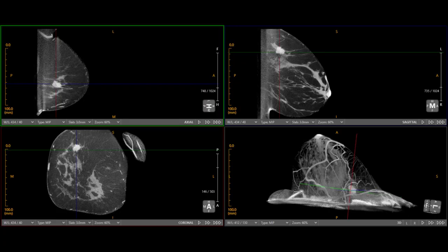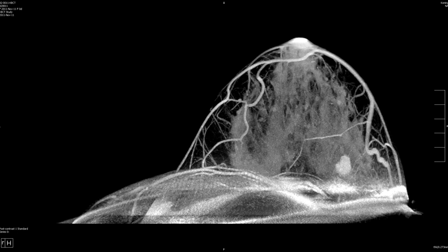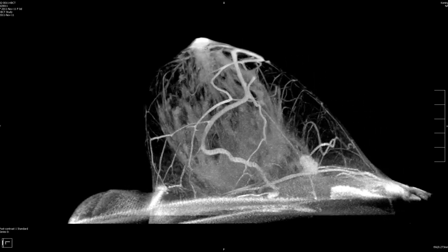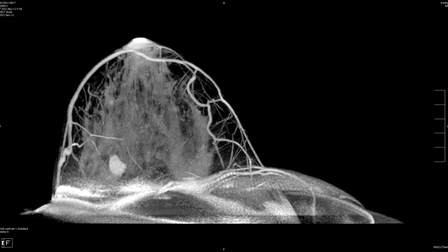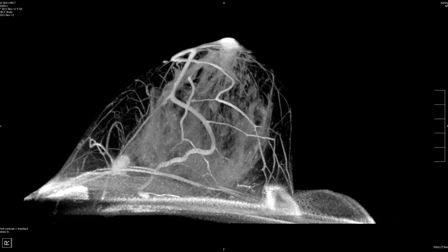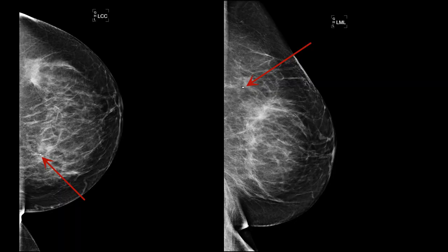Now, with contrast — it's like you switch the light bulb on. You put in contrast and then it jumps. Where else in the body would you ever do a scan for cancer and not give contrast? For dense breasts, we probably need contrast. Here's the contrast exam — it's even more so. That was the lesion in the upper inner breast. She was biopsied and it was cancer. But looking now, all we've done is a needle biopsy, and the cancer without contrast is not as apparent as it is with contrast — there's a lot we're not seeing.